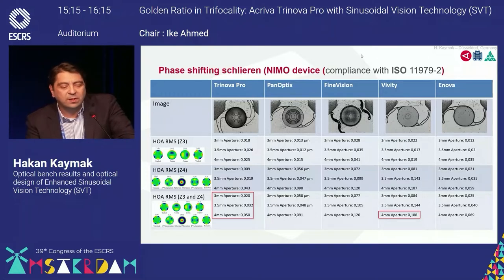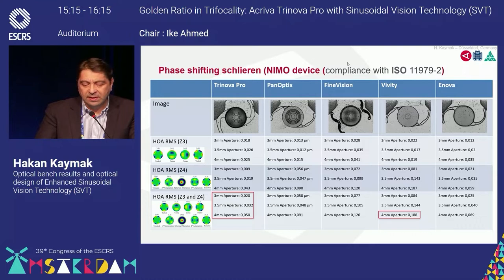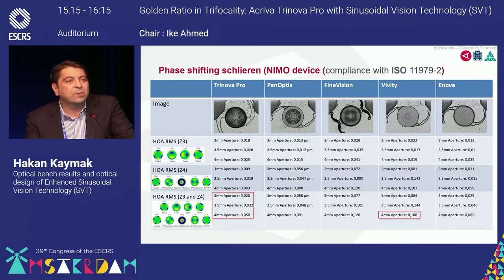What about the optical performance? I think wavefront aberrations are very important, so we checked them for the multifocal IOLs, and as you can see here below, it's really perfect. You have very low values of wavefront aberrations.